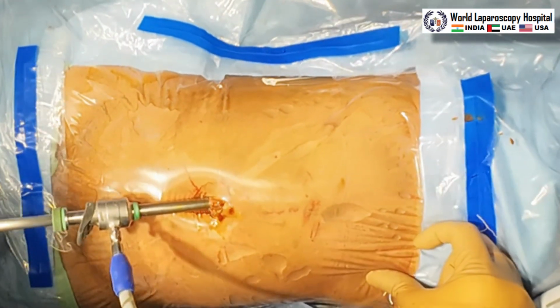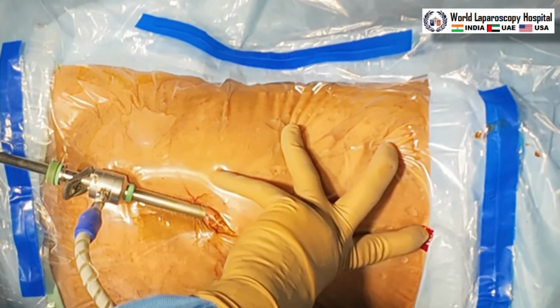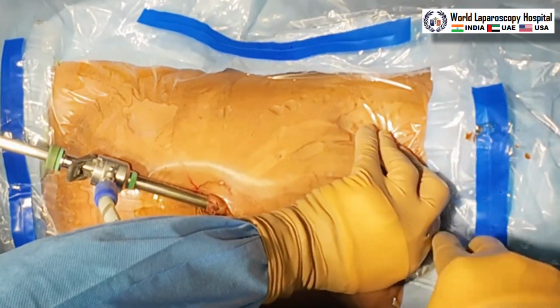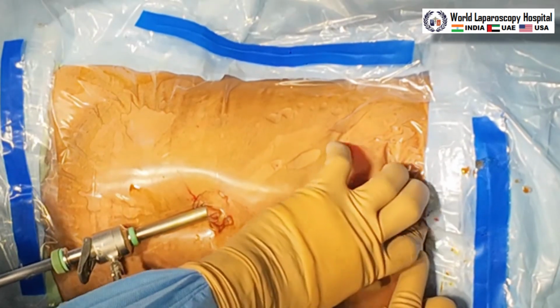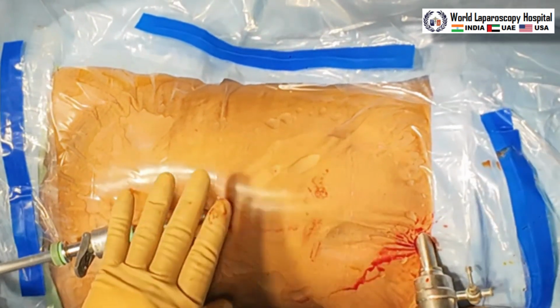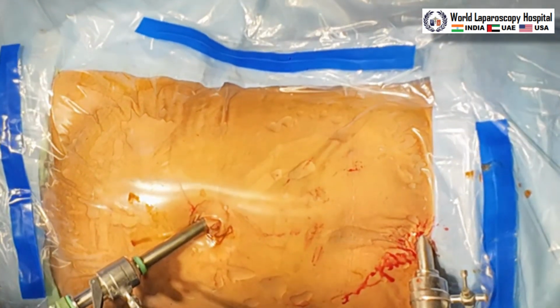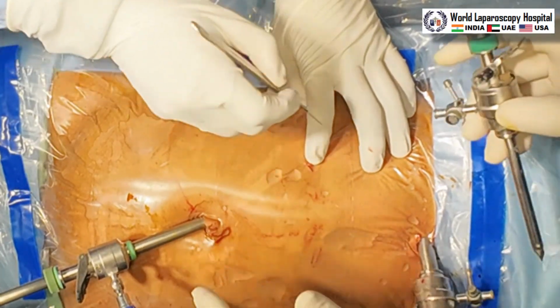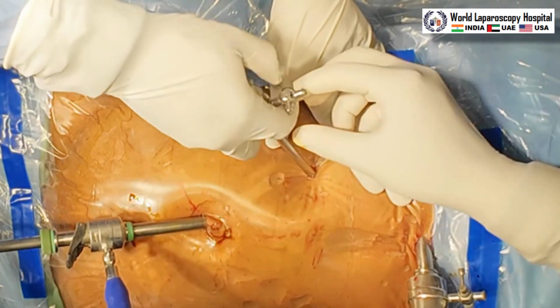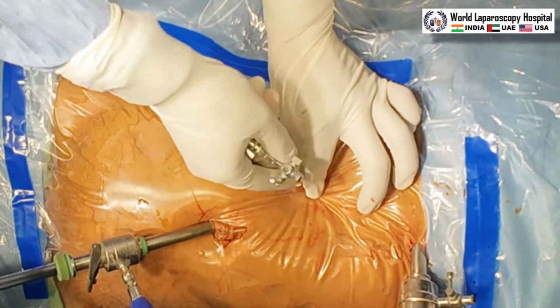The patient's head is going up and now this is the epigastric port. This is also 10 mm, and this is introduced under vision. Now, the third port is introduced. This is in the mid-clavicular line just below the costal margin, or you can see just below the fundus of the gallbladder. This is 5 mm and you or your assistant can put this port. This will be your left hand.